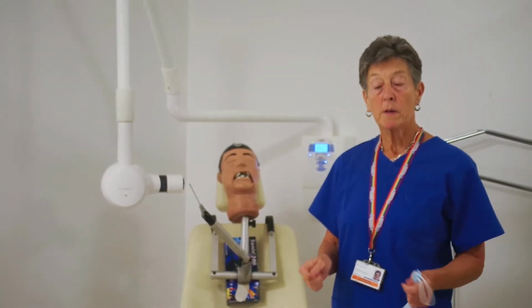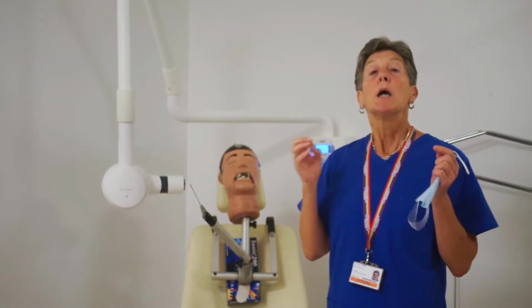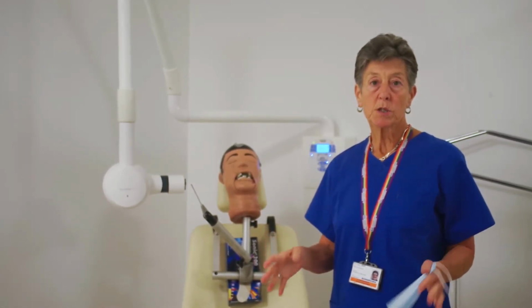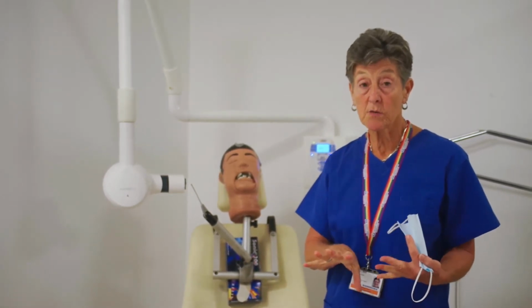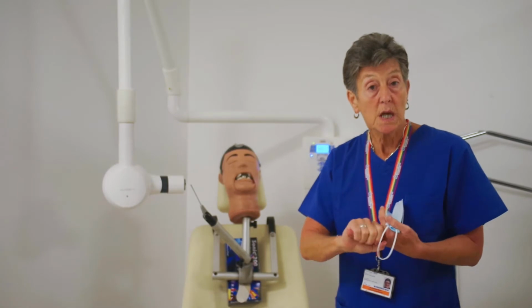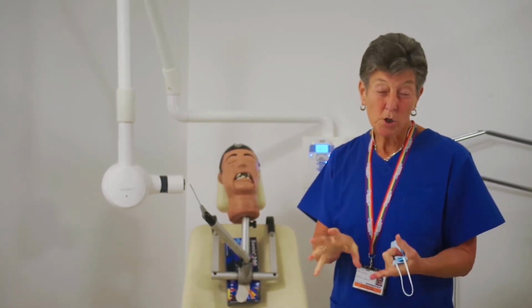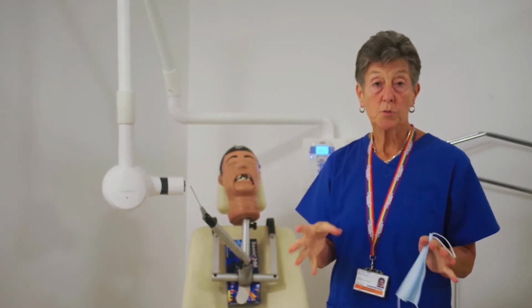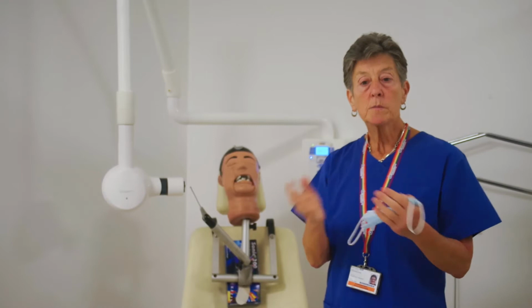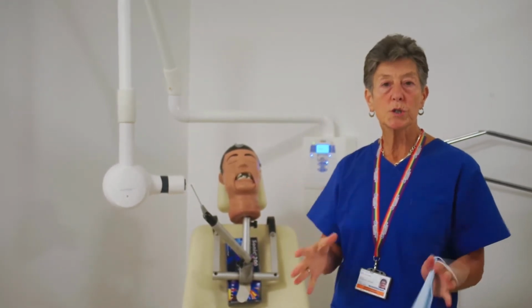Also remember that the speed of your image receptor will also reduce the dose of the patient. So we should be using F-speed film, which you will come across at Southend. Image receptors like charge coupled devices are actually much quicker than the indirect digital, which is what we use here. F-speed film and indirect digital phosphor plates are probably about the same speed, but it all reduces the dose to the patient.